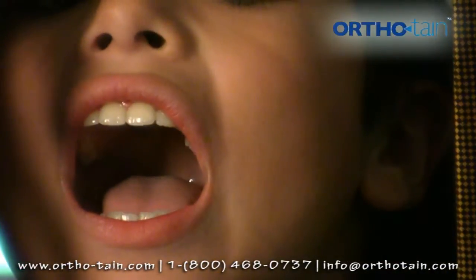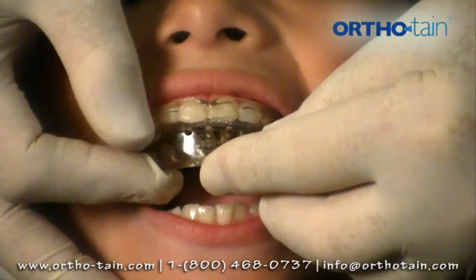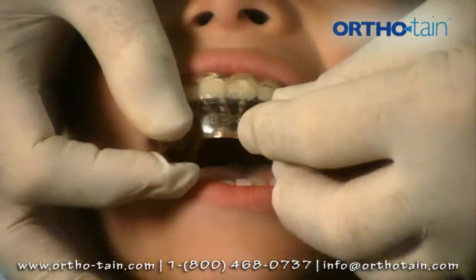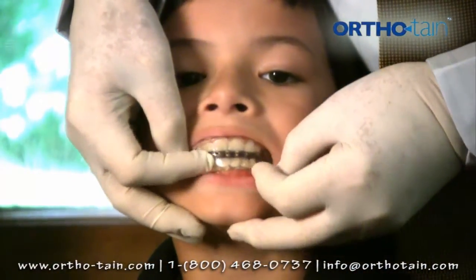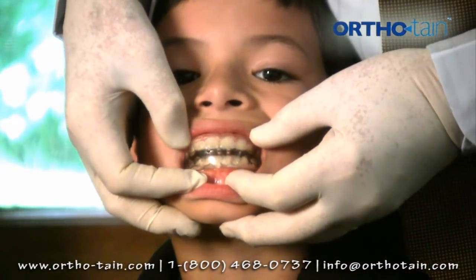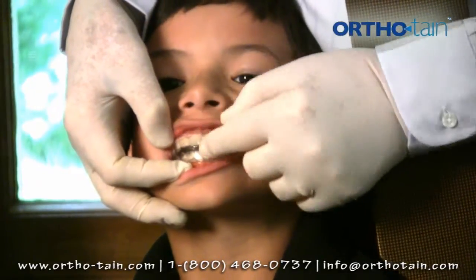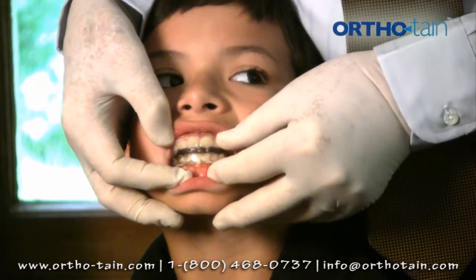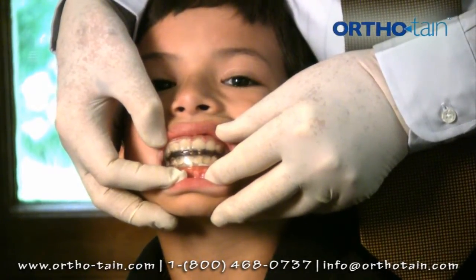So we take a five and a half, put it in, and make sure the upper incisors fit into the slots for those upper teeth, and then you can bite down hard. You can see it fits almost perfectly to those teeth. We also measure to make sure the gum lines don't interfere with the appliance; otherwise we might trim it slightly with a carbide acrylic burr.